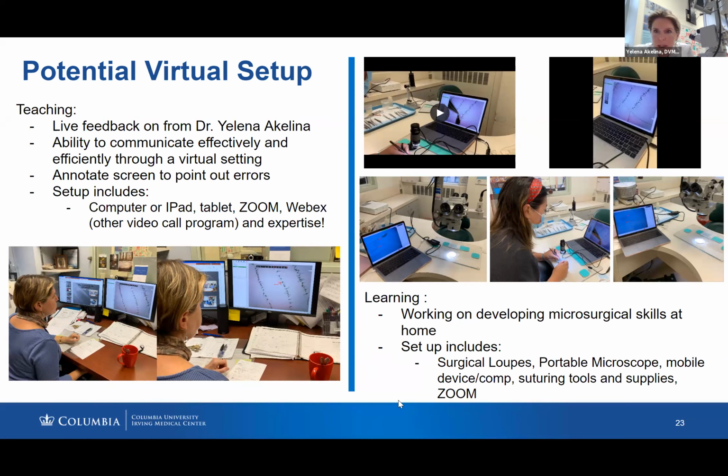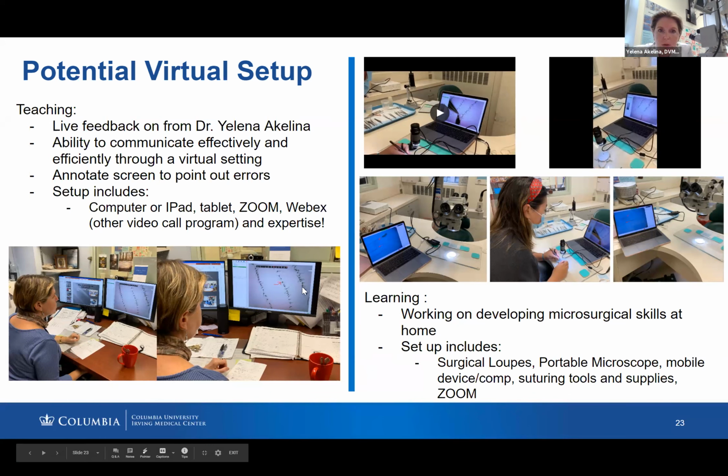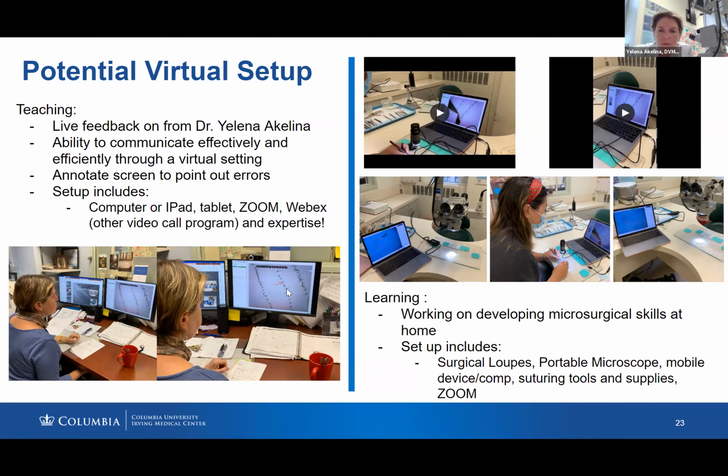We practiced that. I was looking and annotating on these pictures here below. You can see that I'm annotating. I'm giving her my virtual advice. So she's sitting in the lab, I'm sitting in my office, and I have Zoom on my computer, and she has Zoom on her laptop, and we're working together through this micro scale.